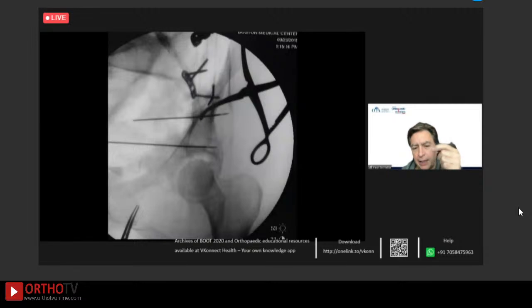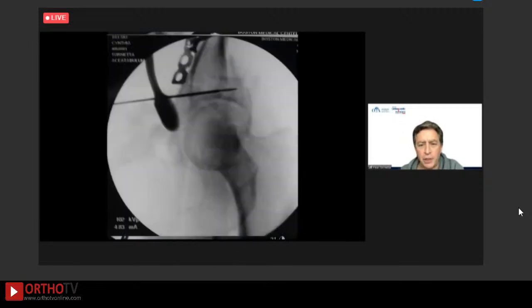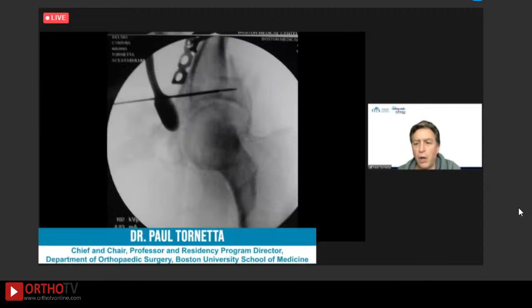And we eventually got it. I grabbed it with a K-wire and pushed on it. And I felt like I was trying to reduce a fracture dislocation of the talus, where I'm not sure exactly what I did at the end, but it sort of looked better. So some kind of magic happened and some luck came in. Maybe she's just a nice person, but we got it to the point where I thought it was reasonably good. And there you see that vertical posterior wall.